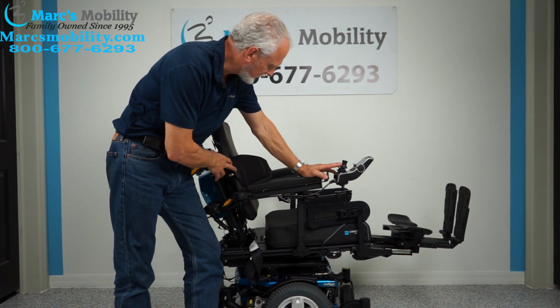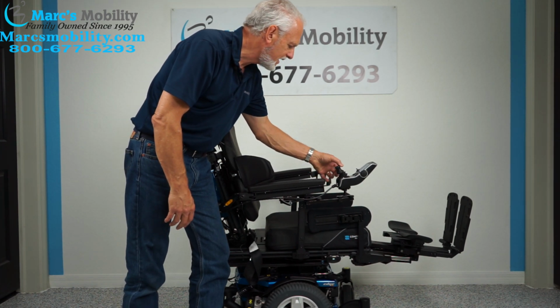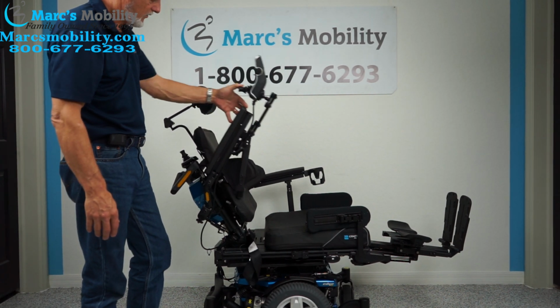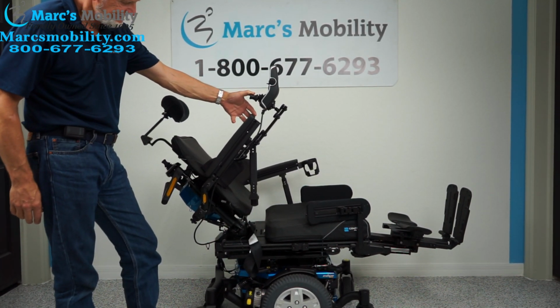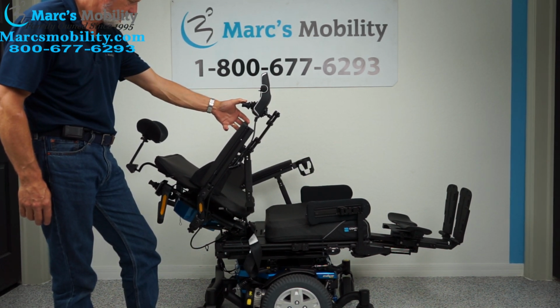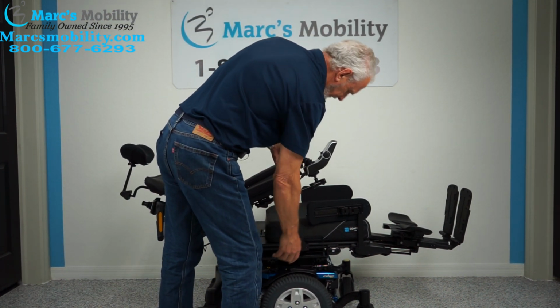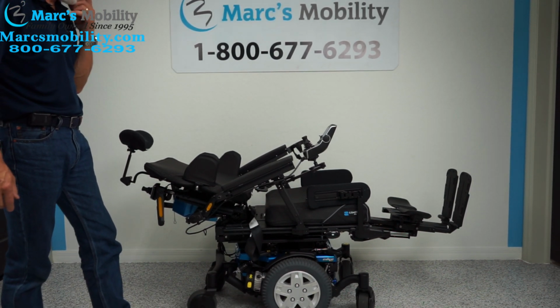The last one is the electric recline. So the electric recline is when the back goes back. I'm holding the button going back now. This is called the electric recline. If you're laying down all the way on this chair, let's see how far it'll go. This is what it would look like if you were laying down in this chair all the way back.